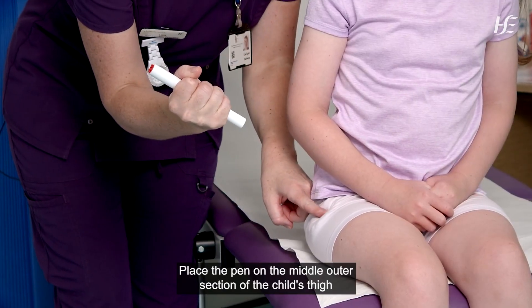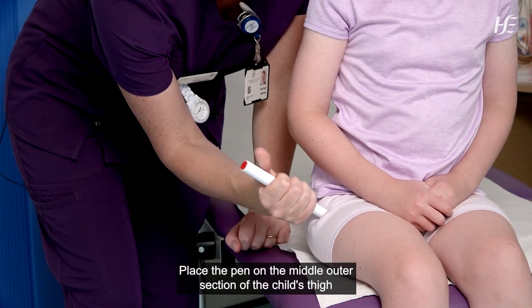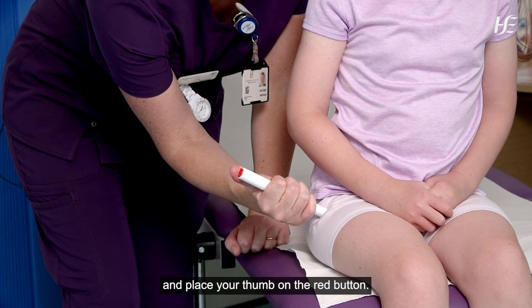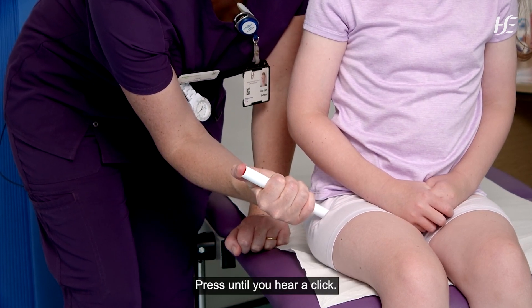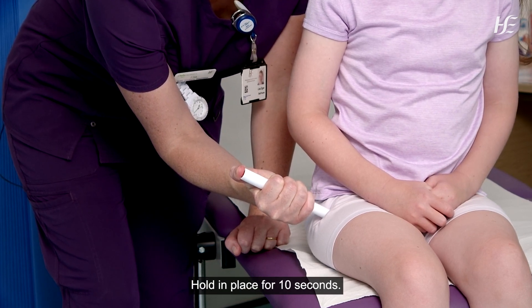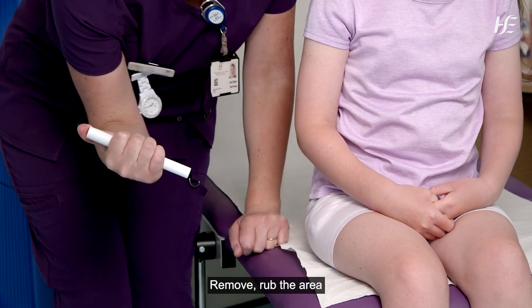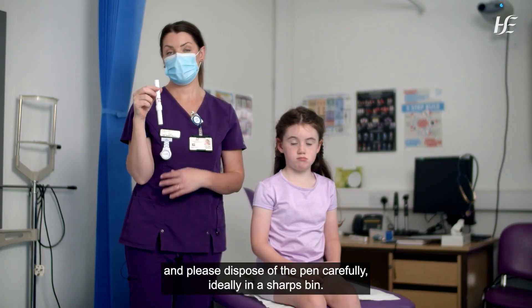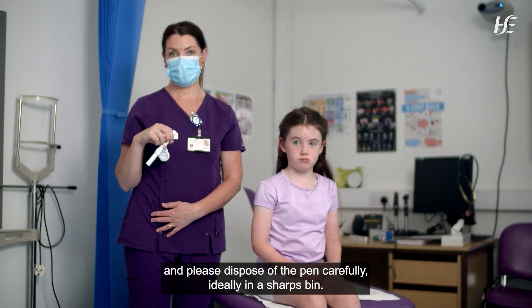This will reveal a red button. Place the pen on the middle outer section of the child's thigh and place your thumb on the red button. Press until you hear a click. Hold in place for 10 seconds. Remove, rub the area, and dispose of the pen carefully, ideally in a sharps bin.